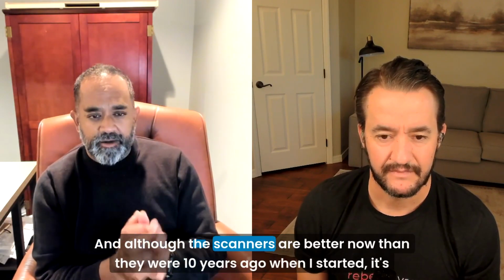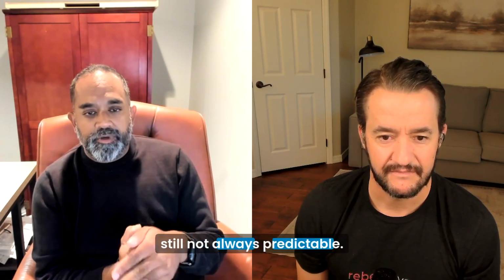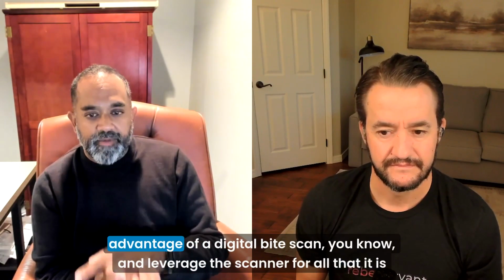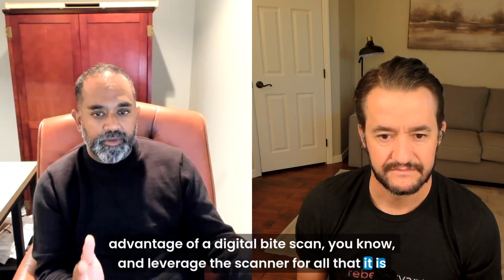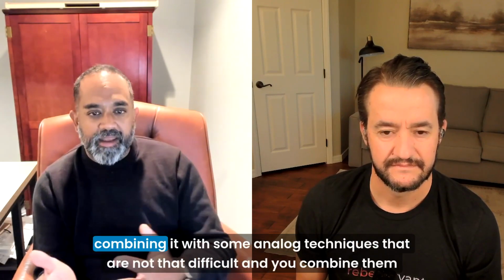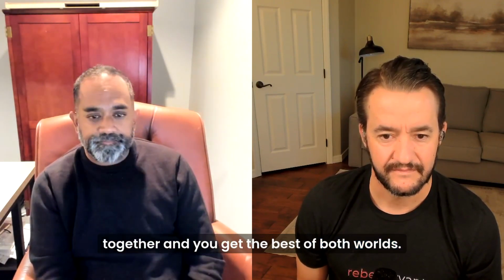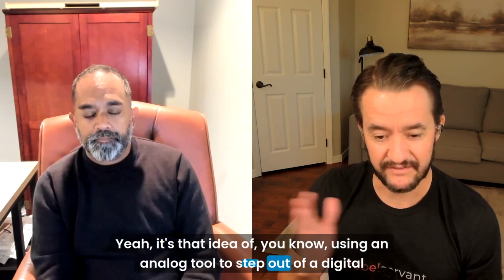And although the scanners are better now than they were 10 years ago when I started, it's still not always predictable. And so there's a couple of techniques that I'll do to be able to really leverage the advantage of a digital bite scan, and leverage the scanner for all that it is working with, but also just sort of combining it with some analog techniques that are not that difficult, and you combine them together and you get the best of both worlds.